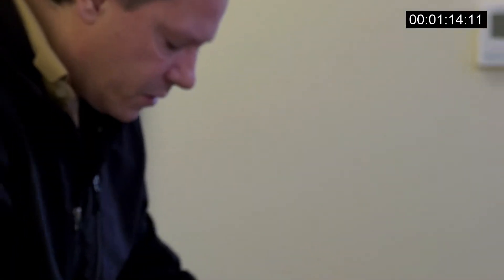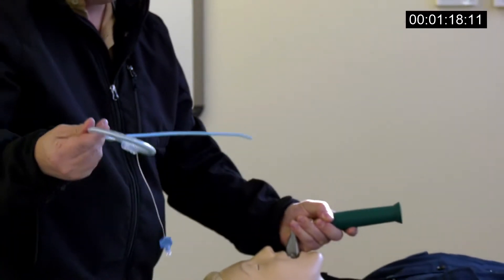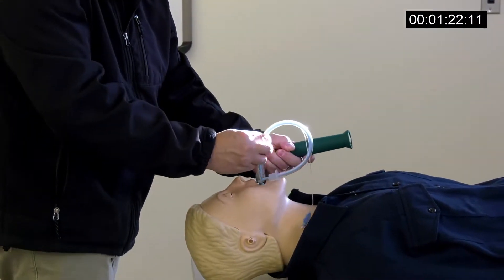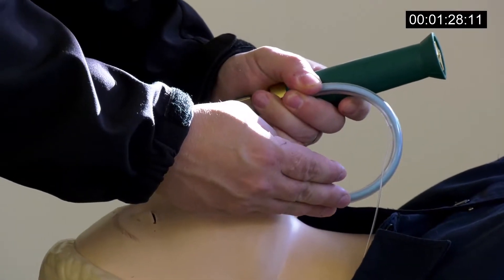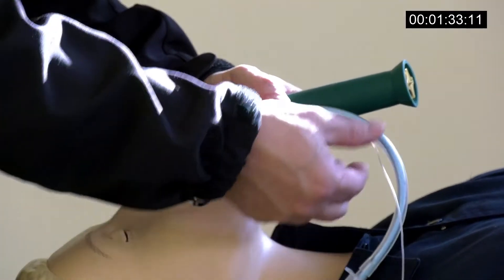Let me show you the process of how this works. Basically, you go in and get the best view that you can with your intubation. I have a grade 1 view — I'm going to stuff this right in the cords here. I'm in there, right until I hit the mouth like this, then I'm going to grab it with the handle, lock it to the handle like this, and use this hand to pop it out of the murphy eye.